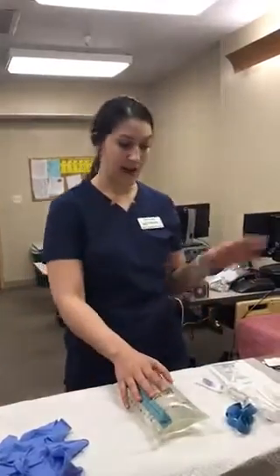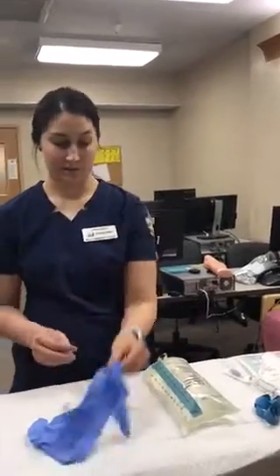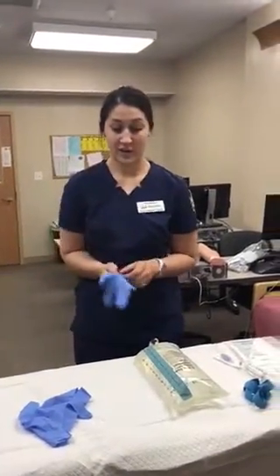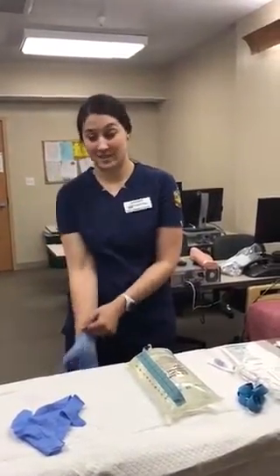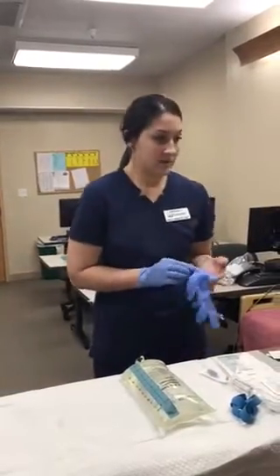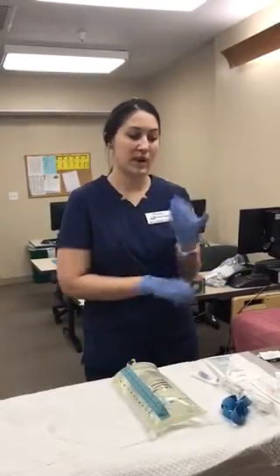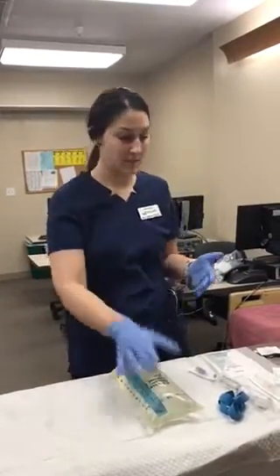So now that that's done and I have washed my hands, I'm going to go ahead and apply my gloves. It's very hard to apply stickers with gloves on because the stickers stick to the gloves. So again, I've already checked with the MAR that this is the right solution, the right patient, and I have my labels already made.